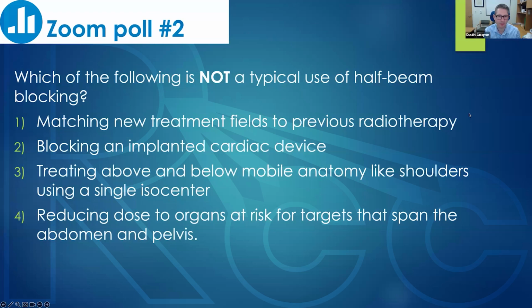That's typically a concept associated with IMRT and inverse planning. That being said, turning the collimator can change your field design quite a bit. If you have a really long field, for example, having the collimator angle oriented such that the MLCs are coming in perpendicular to the long target can help make the plan more conformal. And that can change the quality of the plan quite a bit.